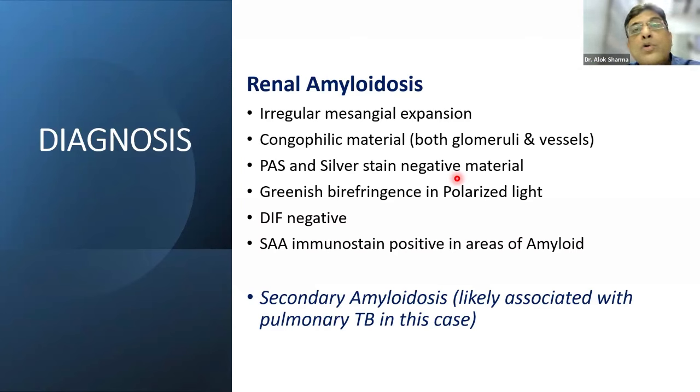One of the most common types of amyloid deposits are light chain amyloid. So you will be able to pick up your amyloid deposits by doing your routine kappa and lambda staining. Most of the times the amyloid deposits have a tendency to be lambda light chain restricted. So that's the first step.